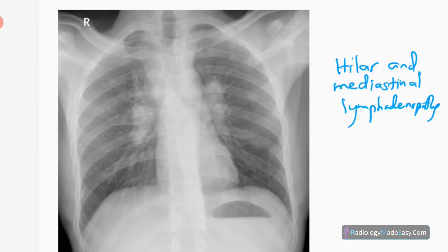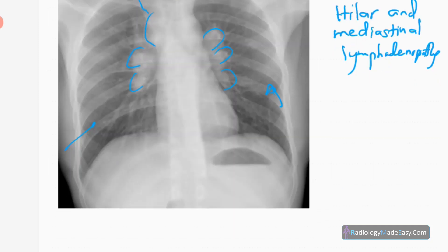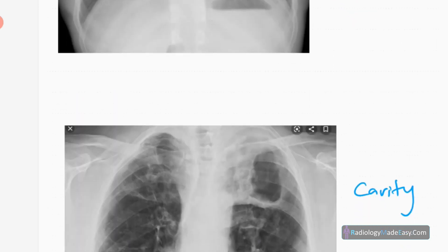Next is lymphadenopathy in TB. You can see multiple hilar prominences and right paratracheal prominence — hilar and mediastinal lymphadenopathy. The differential diagnosis for this appearance includes sarcoidosis stage 1 and lymphoma. The lung fields are relatively spared with no effusions. The main finding is hilar and mediastinal or right paratracheal lymphadenopathy.